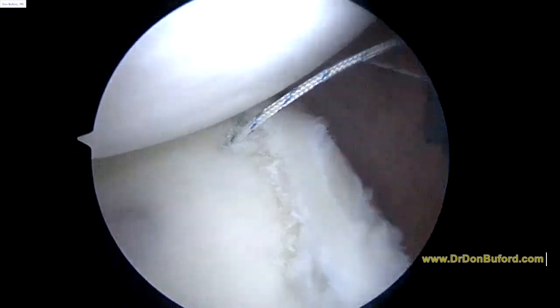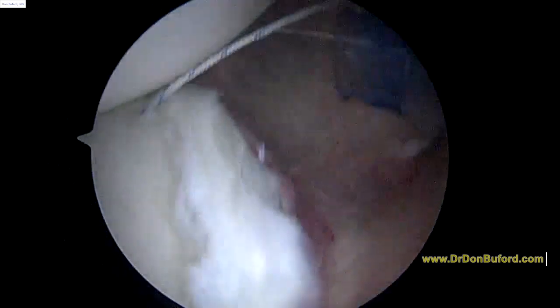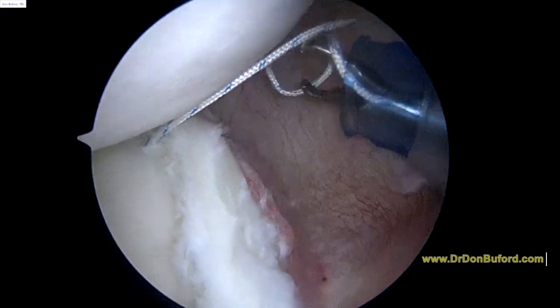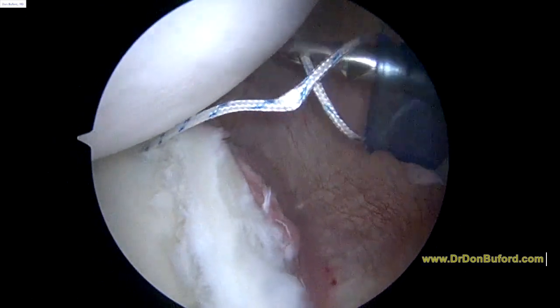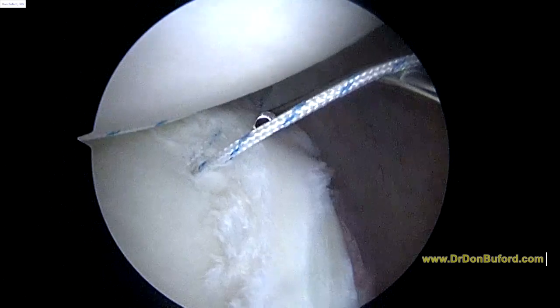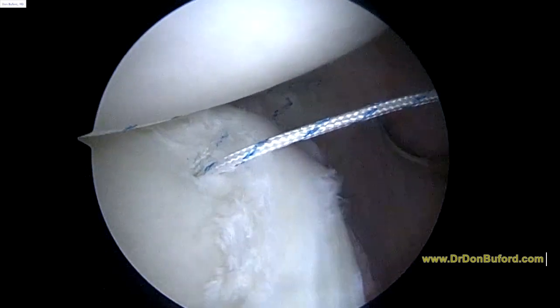And now we're going to do what we call a figure eight mattress stitch, which means that we're going to take that same suture and pass it underneath one more time. We're going to pull this one down out of the way. We're going to take this one and pass it back here again. Okay, for the second pass, we're going to go into the capsule a little bit more superior here.